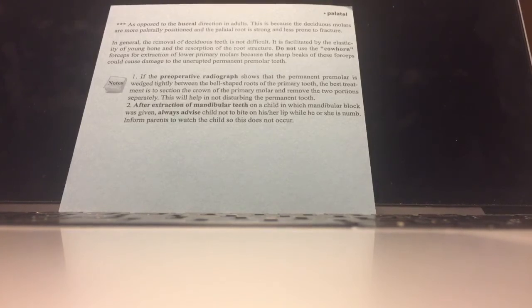Obviously, do not use cowhorn forceps for extraction of lower primary molars because the sharp beaks of these forceps could cause damage to the unerupted permanent premolar teeth. If the preoperative radiograph shows that the permanent premolar is wedged tightly between the bell-shaped roots of the primary tooth, the best treatment is to section the crown of the primary molar and remove the two portions separately. This will help in not disturbing the permanent tooth.